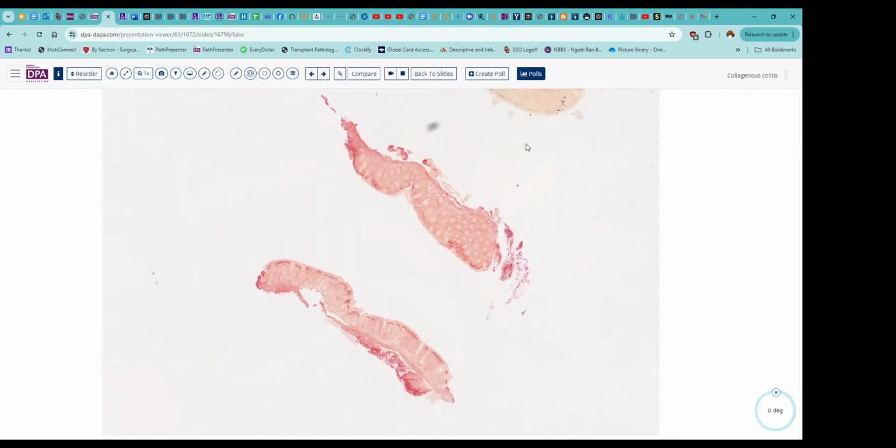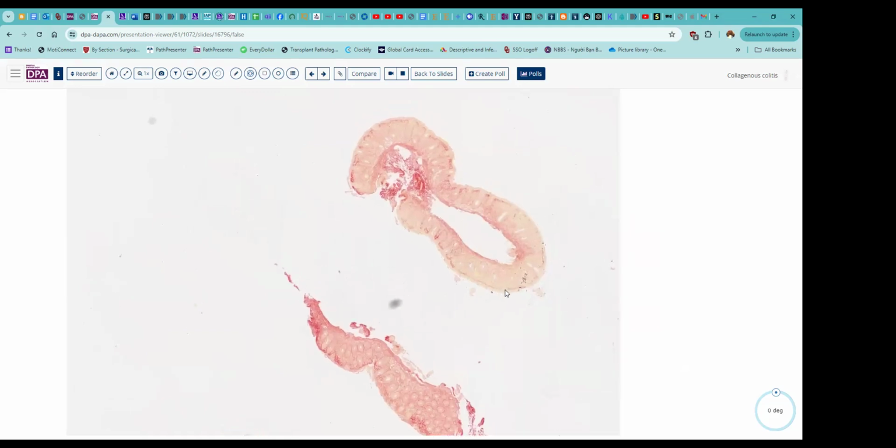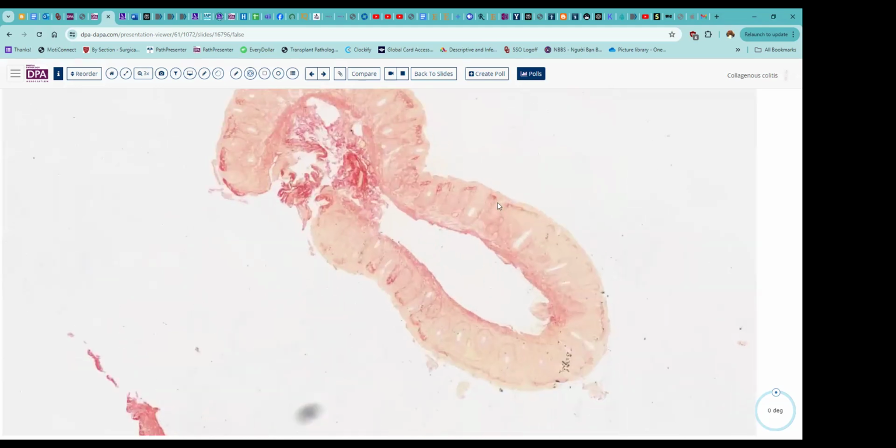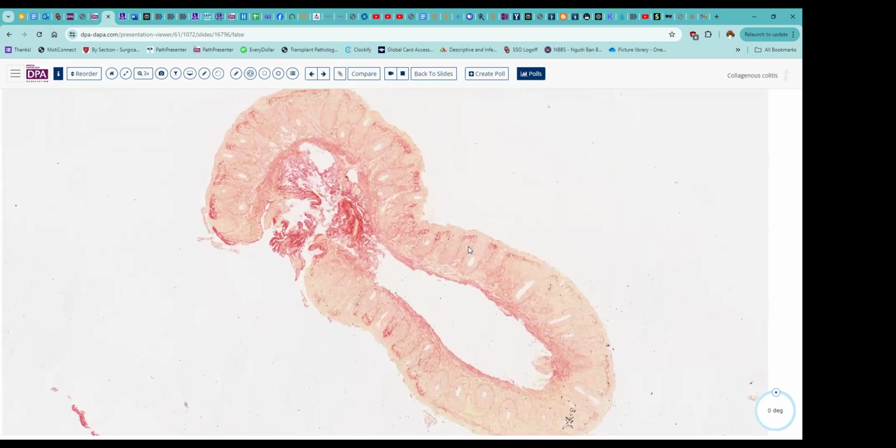Now, typically this presents in older women with watery kinds of diarrhea. And of course, that is the classic presentation, but we can see it in other settings as well. This basal collagenous deposition can also on occasion occur in other locations, in the stomach, maybe the small bowel occasionally, but the significance in those locations is a little bit less certain. And it may be associated with some, of course, lymphocytic or other features of microscopic colitis.